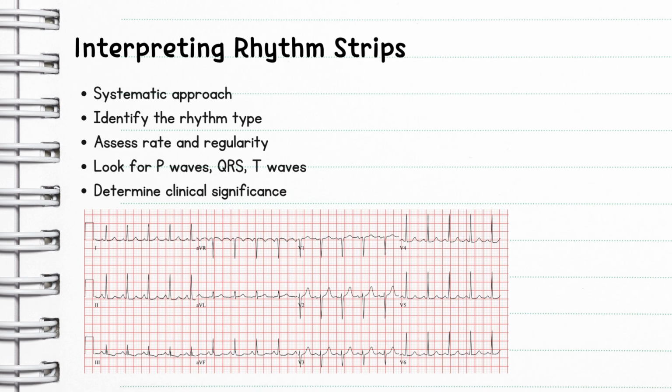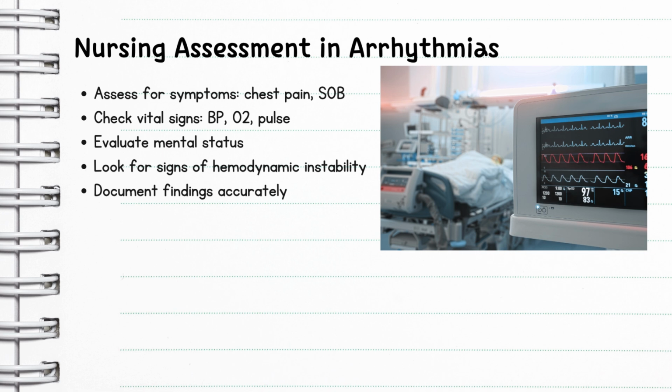And then finally, you're going to tie it all together by determining the clinical significance of what you're seeing, and always tie it back to how the patient looks, right? We're not just treating a monitor, we're treating the patient too. So you're going to ask yourself, is this rhythm even compatible with life, or does it need something immediately to save their life? Kind of important to know.